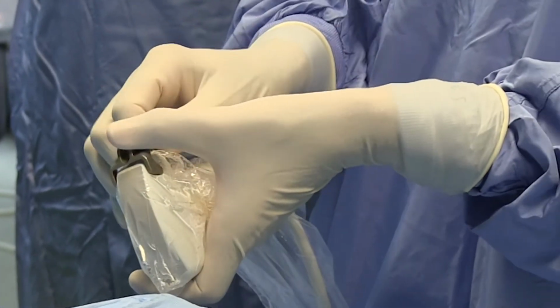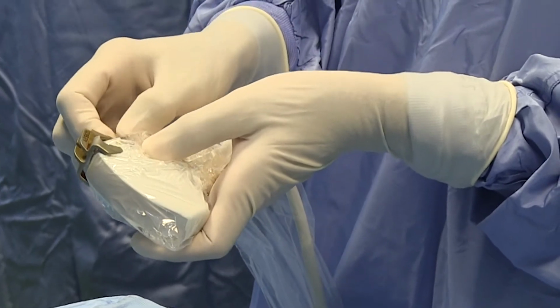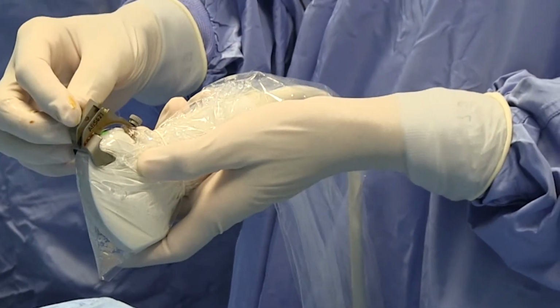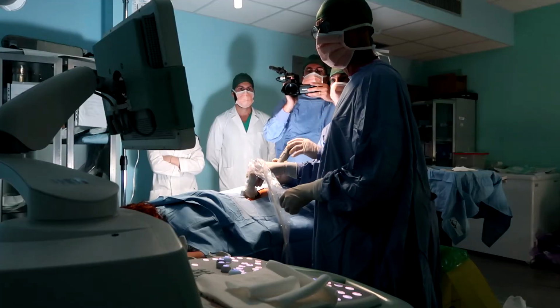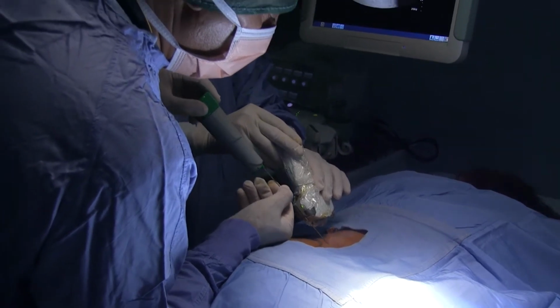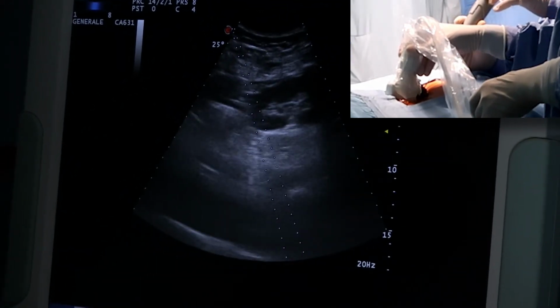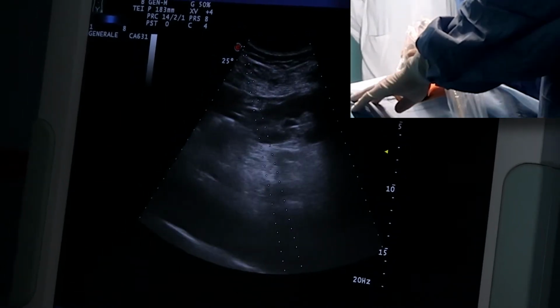Ultrasound guides are placed on the probe in order to lead the needle through the path that simultaneously is displayed on the ultrasound monitor. The angle of the guide is set up on the ultrasound before starting the procedure. The needle is introduced through the same path that was used to carry out anesthesia into the renal capsule. The patient is then asked to stop breathing in order to fire the needle into the kidney.